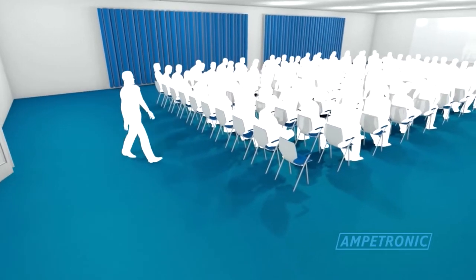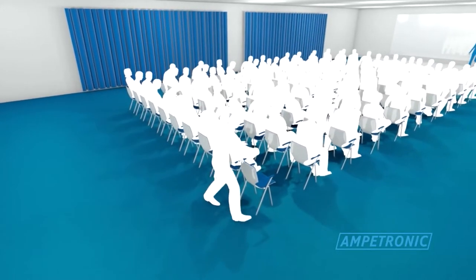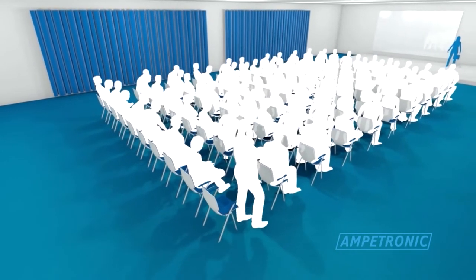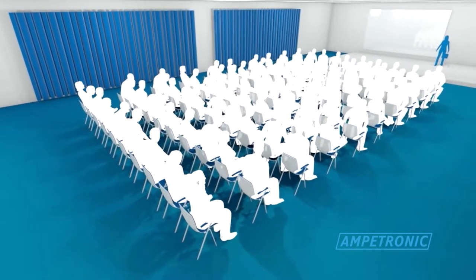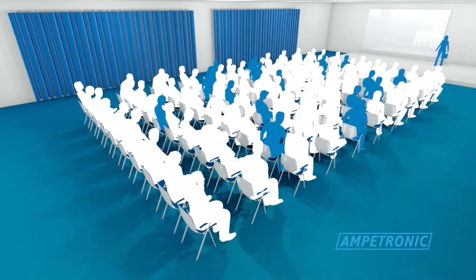A common place to encounter an area coverage loop facility is in a conference room. As many as one in every six people experience some degree of hearing loss, a number that represents a significant proportion of the population.